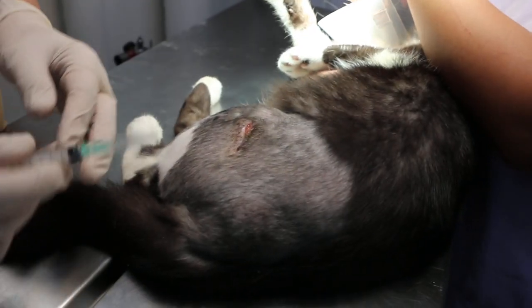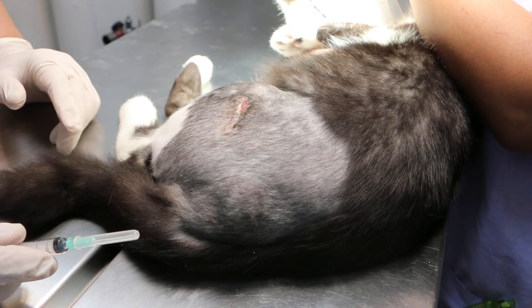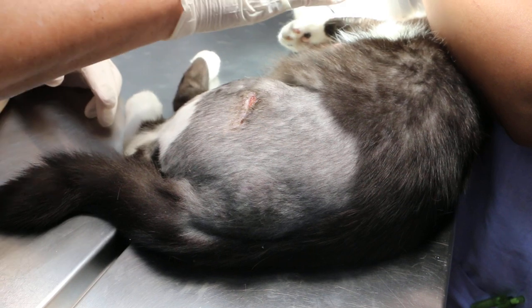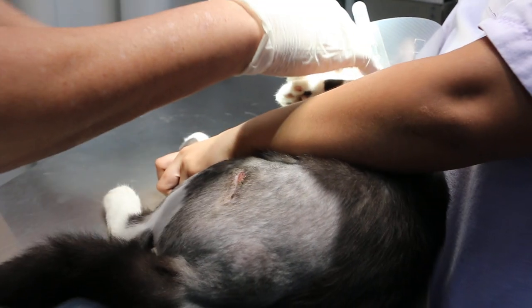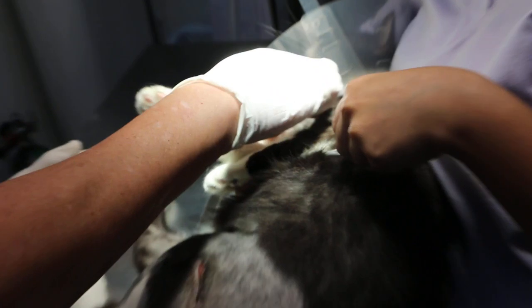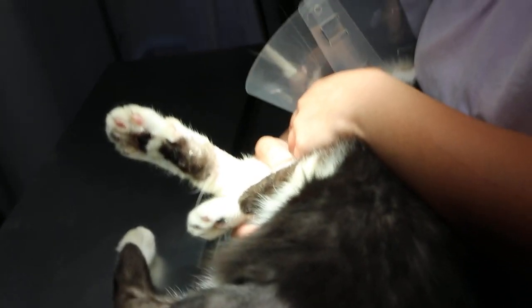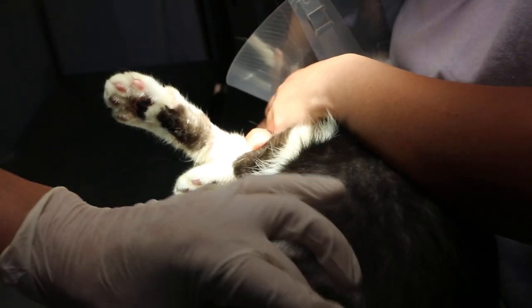There is still a bit of swelling here. Normally if the handler can hold the cat, that is the best — not by gripping the cat. The less you grip it the better. The best is to tickle the throat so the cat will be distracted. Now I will quickly swab this area.